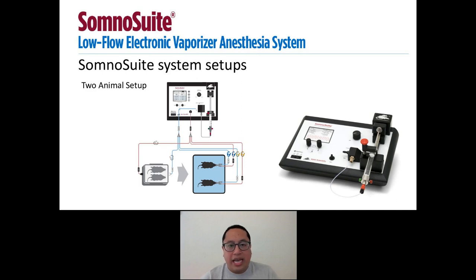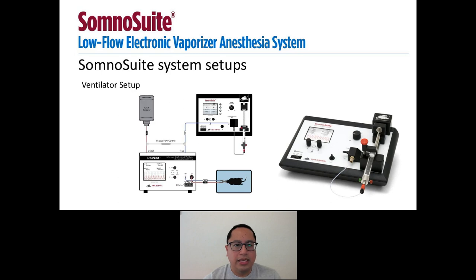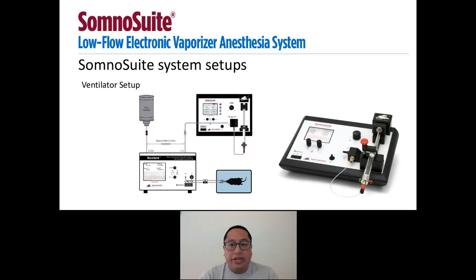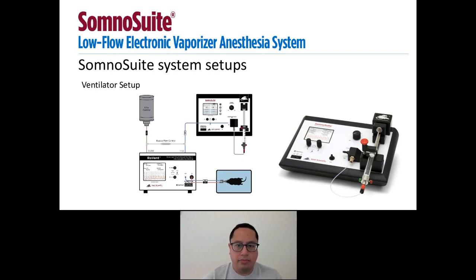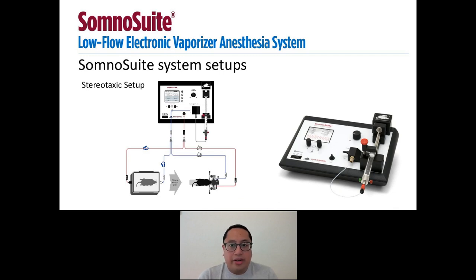This diagram shows how a three accessory adapter can be used to connect the SomnoSuite to a standalone ventilator, such as our RoVent system. If you are performing stereotaxic surgeries, the SomnoSuite can also interface with your stereotaxic frames using the two accessory adapter as well.